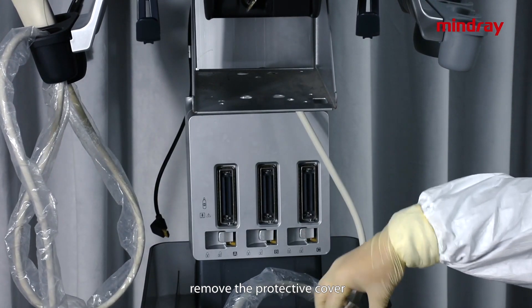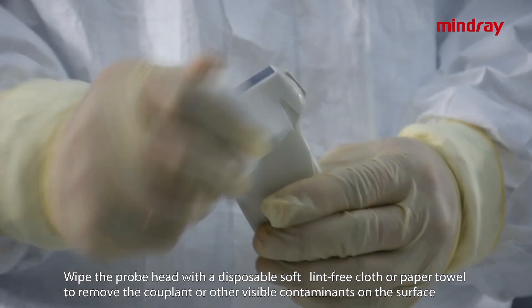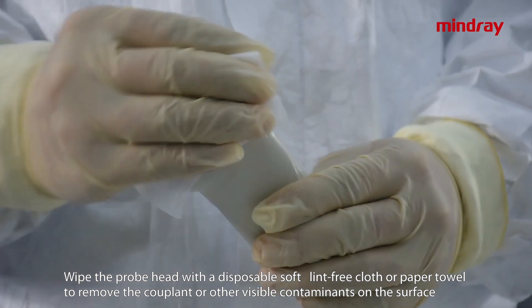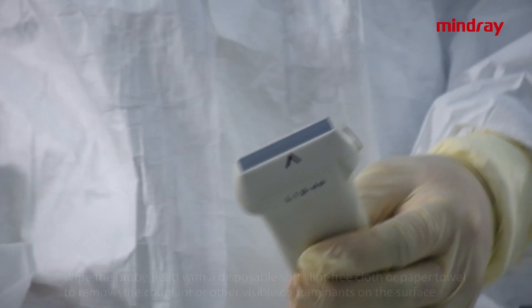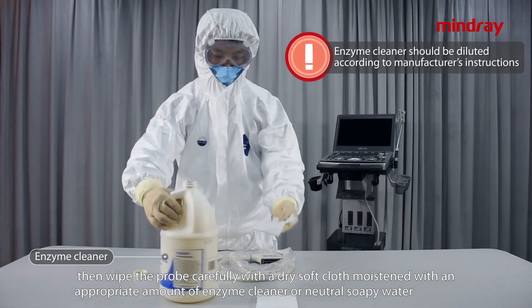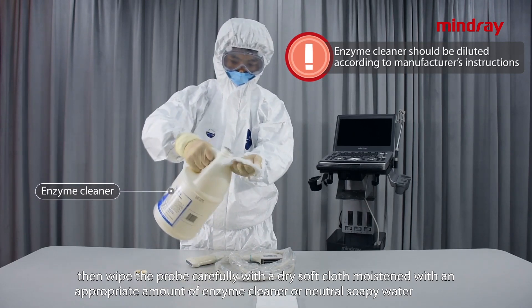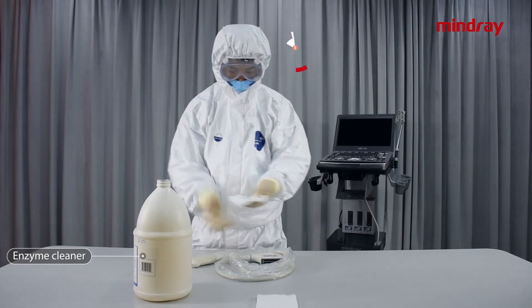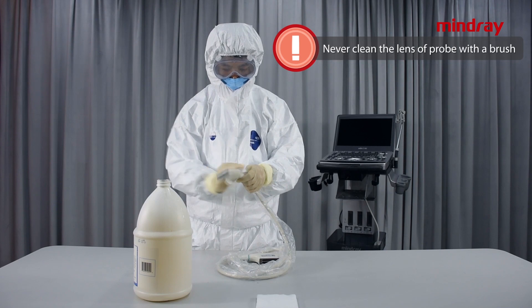Remove the probes from the PEM. If there is a protective cover on the surface of the probe, remove the protective cover. Wipe the probe head with a disposable soft lint-free cloth or paper towel to remove coupling gel or other visible contaminants. Then wipe the probe carefully with a soft dry cloth moistened with an appropriate amount of enzyme cleaner or neutral soapy water. Caution: never clean the lens of the probe with a brush.